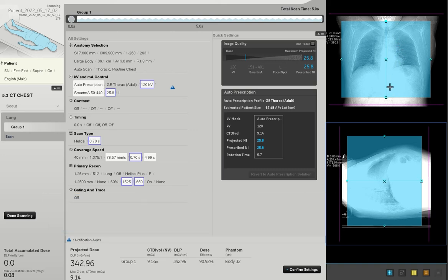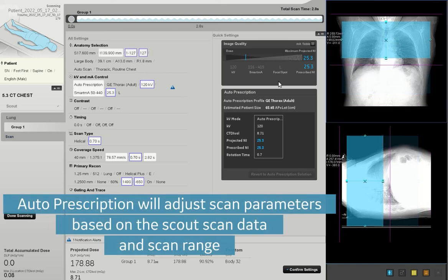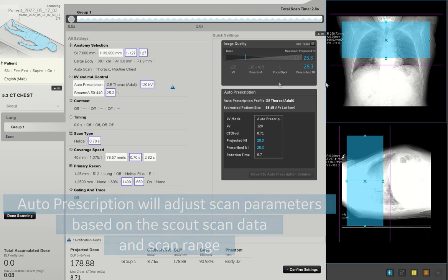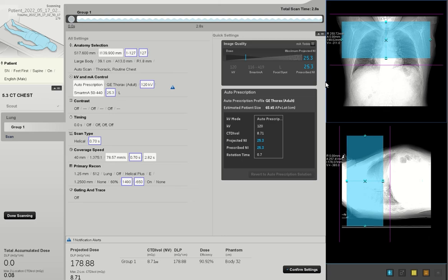As this scan range is changed, auto prescription will automatically change factors such as kV and rotation speed to ensure the best image quality at the optimal dose level for each particular exam.